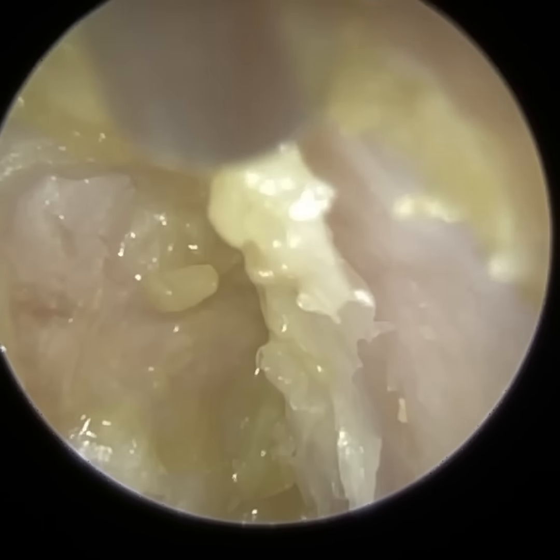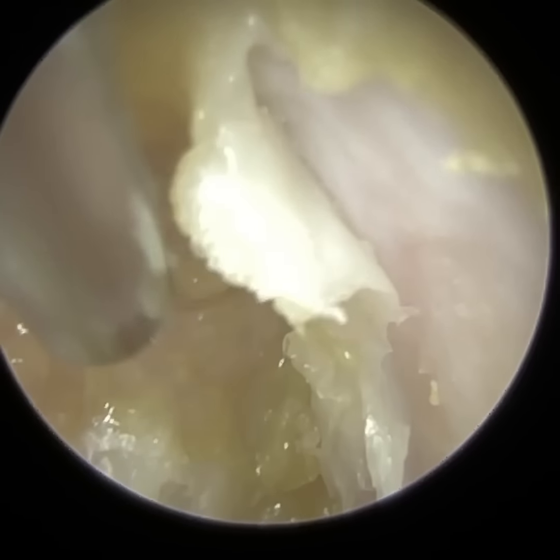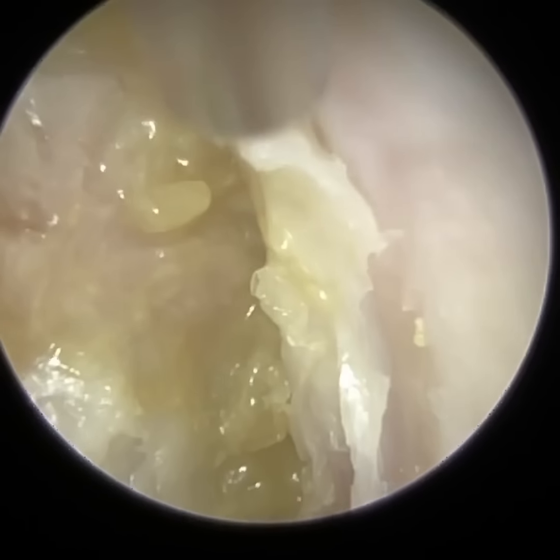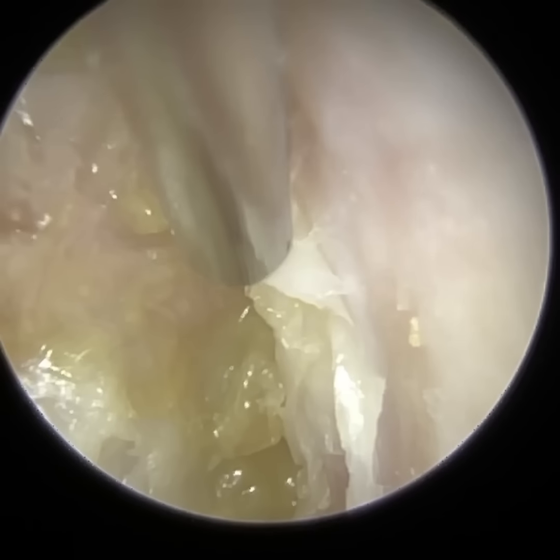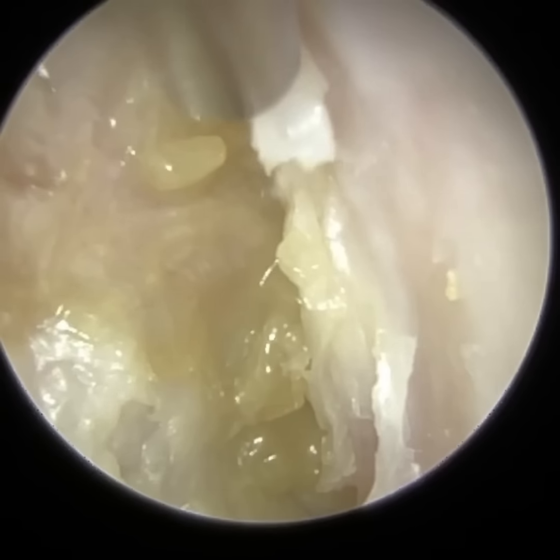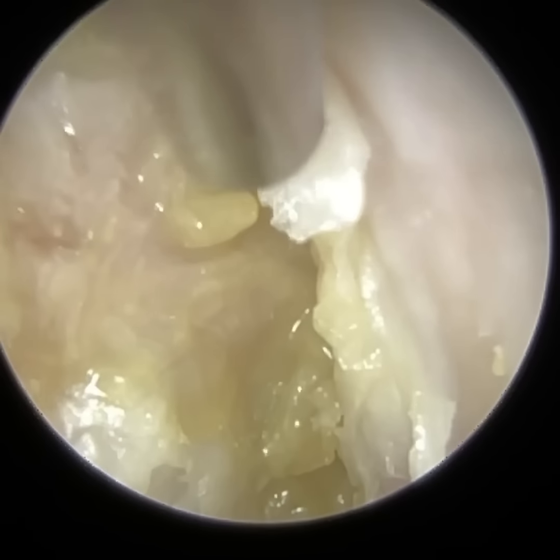So I used the forceps eventually, managed to remove the main bulk, and now you've just got this really thick semi-desquamous skin, so it's still partially attached to the canal, and it's a very thick blanket, very difficult to remove. So I did find this quite challenging, actually.